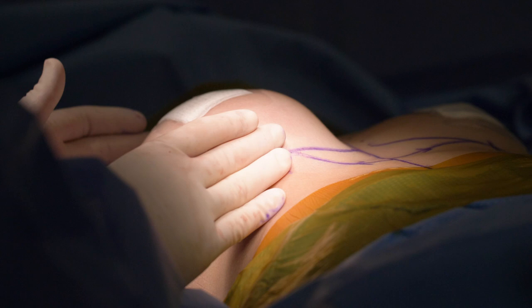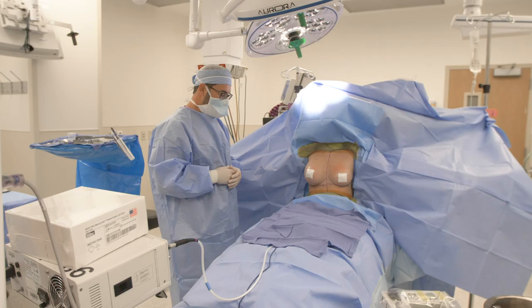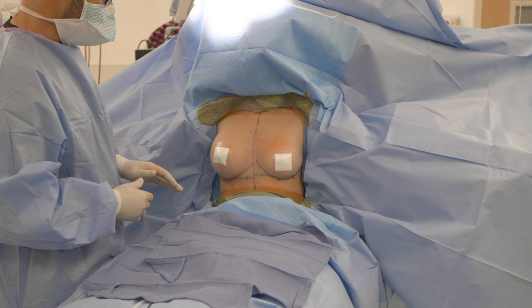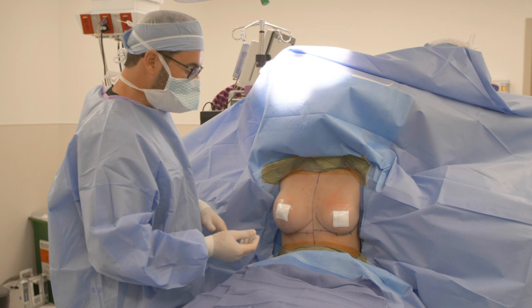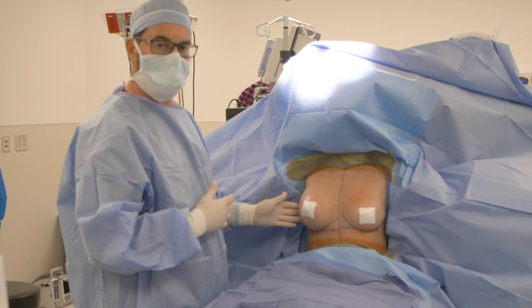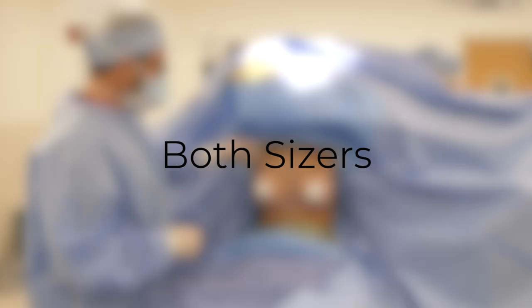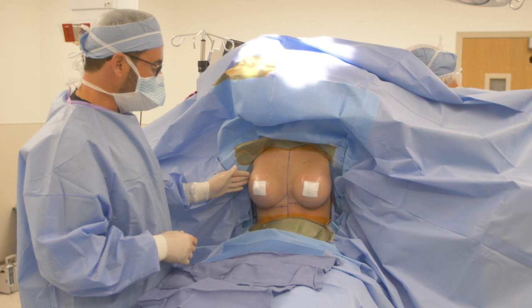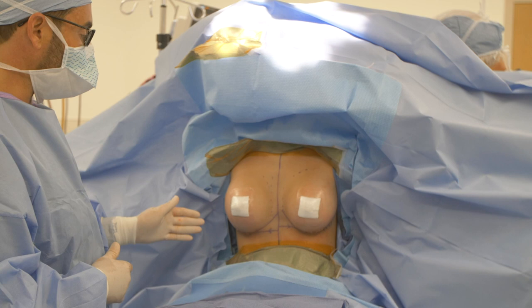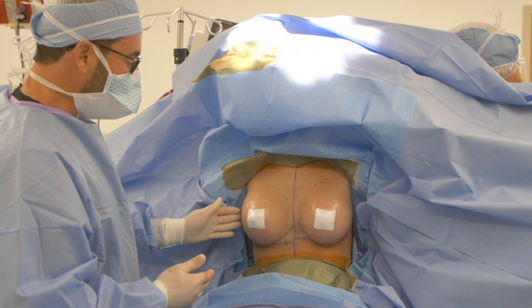We've tailor-tacked the incision and we're going to sit her up to see if we have nice contour, if our pocket needs any more manipulation, and if we like the size. You can see we have a sizer in on this side and no implant on the other side. She has really pretty breasts to start — nice shape, well-defined inframammary folds — but with the implant on this side she has nice upper-pole fullness and just a little more volume. She's really going to fill out clothes and bathing suits and be a lot more proportionate. The sizes are in, the pockets are dissected, and she has a very pretty result — nice upper pole fullness, nice lateral pole fullness, and nice symmetry. The implant size really fits her body nicely, not too big, not too small, and gets her to the desired shape.